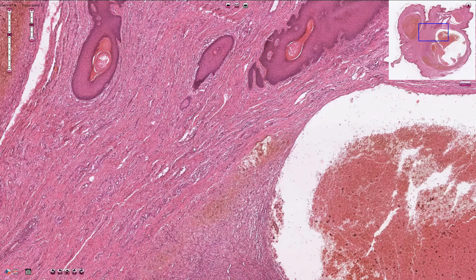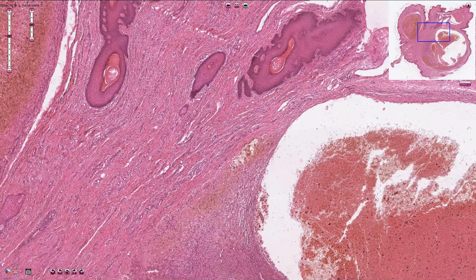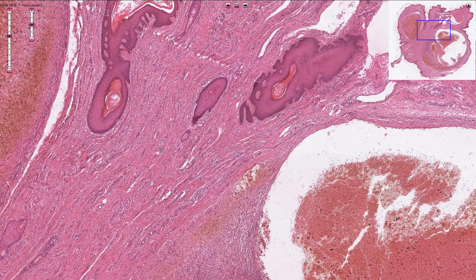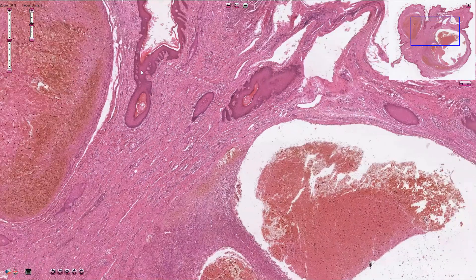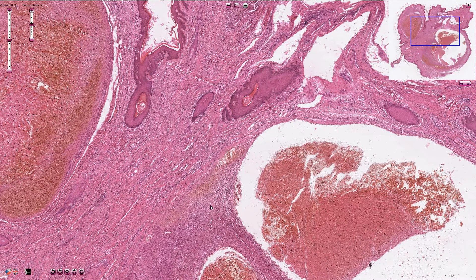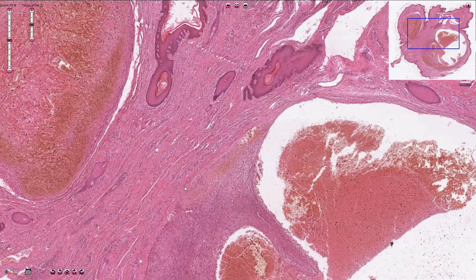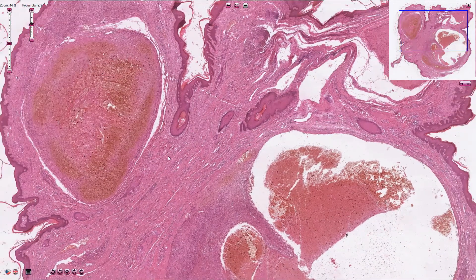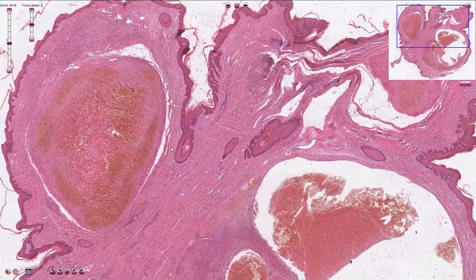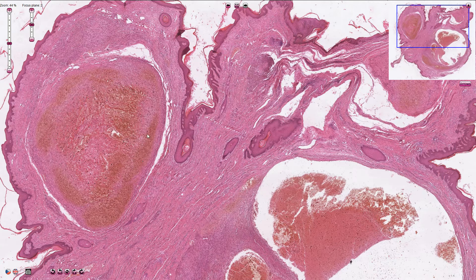The overall shape is quite polypoid, so we can ask where this specimen is localized. It is not a mucosa because of keratinization — this is really an epidermis. You can see a polypoid shape and dilated blood vessels, so I think we can make a good guess that we are looking at hemorrhoids with a dilated hemorrhoidal venous plexus. Because we don't see columnar epithelium of colonic type, we are probably somewhere below the dentate line, and these veins are from the inferior hemorrhoidal plexus.